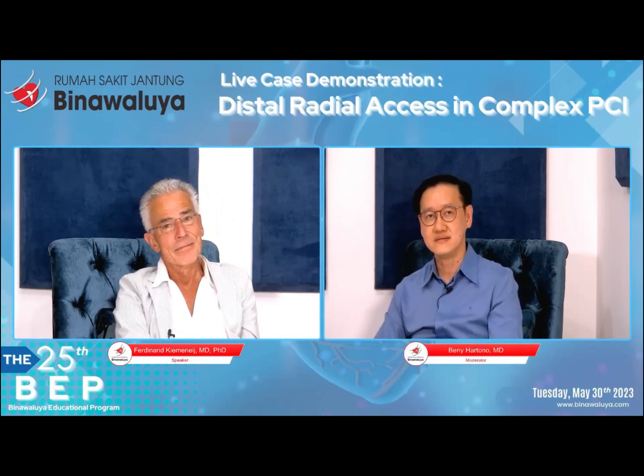So I just want to make a summary of this morning's presentations and live cases. We see that distal radial has many advantages. First, radial artery occlusion is lower than with conventional radial interventions, and also the bleeding and hematomas are less, and it is also convenient for the operator. And about crossover, I think it's not a problem here. We still use the hands for the interventions here. So what I get from here is, if you do a distal radial, you only gain, not lose. Because if you cannot do this, you just change to another side. So you have other options. So it's not a loss, it's only gain. I completely agree. Nothing to lose, only gain.